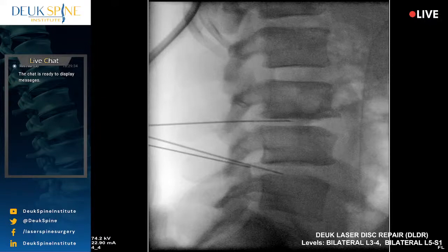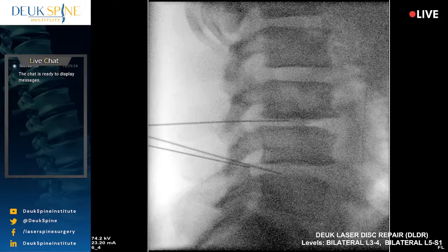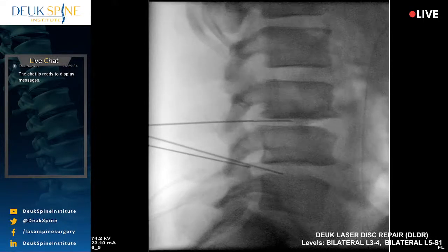You can see the herniation there is huge. Literally poking out, almost touching the facet joint. You guys see that? I mean, if you look at the second needle tip, it's like right there. Yeah, it's perfect. So go back and take another picture. I want to show the audience and my patient for later exactly where that herniation is. You can see the herniation on x-ray. That's how big it is. One more. Yeah, we were a little bit rotated, but you can still see it. Show it to them. My God, that thing is huge.